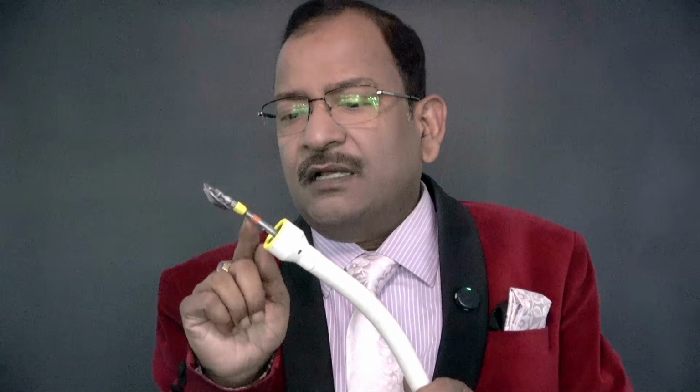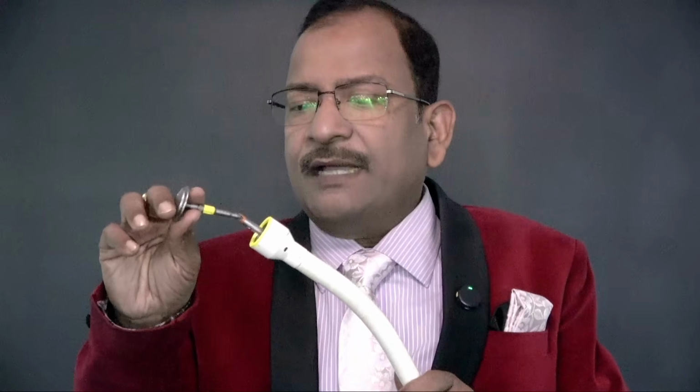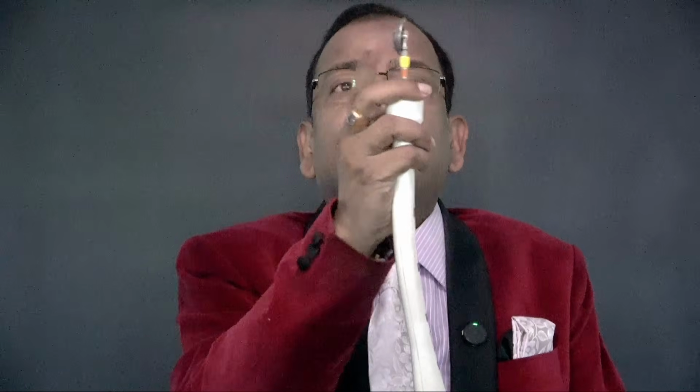You must face this yellow color, and this yellow color should come into this green color, and it will give you a click, click. When the green and yellow are touching together, that means it is okay. So it will go like that, and once you push this, a sound will come. Then you will start, and remember, at the time when you are tightening, it should be perpendicular. It should not be longitudinal. It should always be perpendicular.